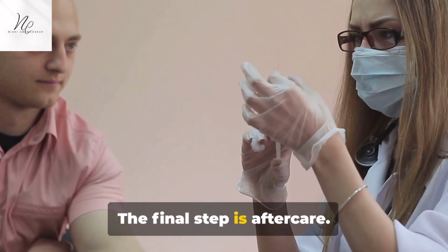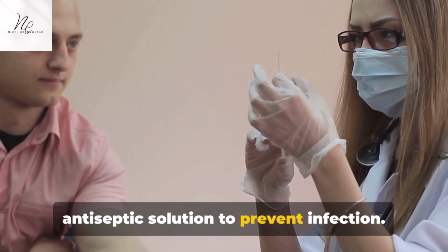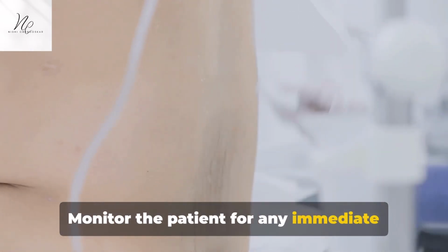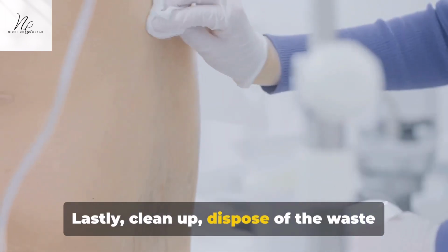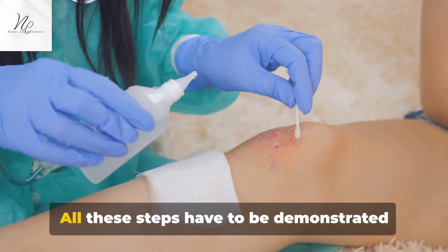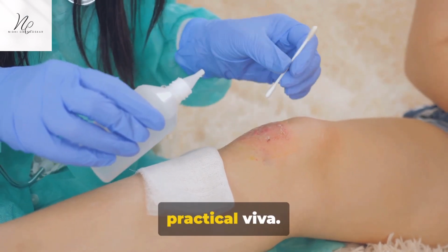The final step is aftercare. Clean the injection site with an antiseptic solution to prevent infection. Secure the injection site with an adhesive tape. Monitor the patient for any immediate adverse reactions to the medication. Lastly, clean up, dispose of the waste safely, and wash your hands. And that's how you administer an intravenous injection. All these steps have to be demonstrated during your second MBBS Pharmacology Practical Viva.